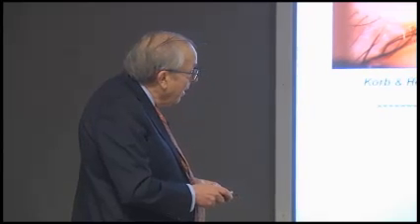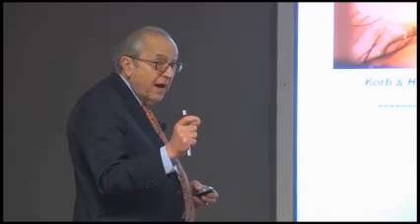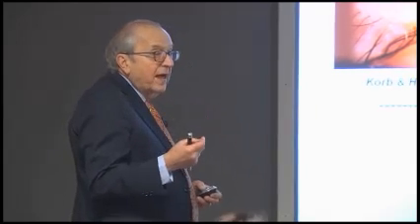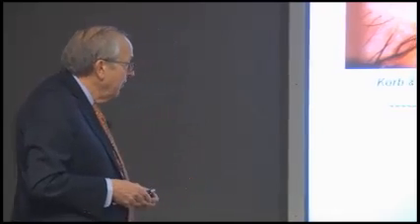And there it is being applied and coming up, and you hold that on for 5 seconds, 10 seconds. And then the goal of that is to see how many glands are secreting. And what we very quickly understood was a statement by Kuhn, who was one of my favorites, that he came up with the words new paradigm. In The Structure of Scientific Revolutions, he said that in the absence of a metric and an objective method of evaluation, both fact gathering and development are really very severely impeded.